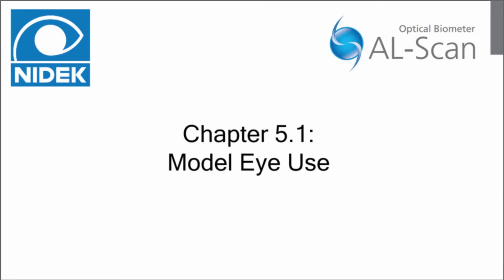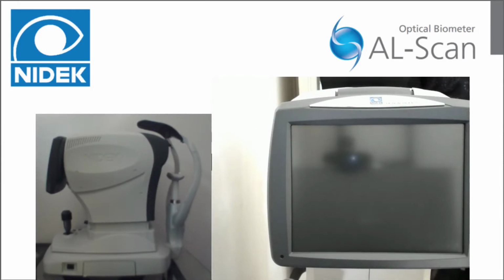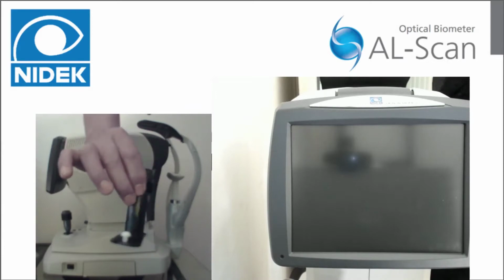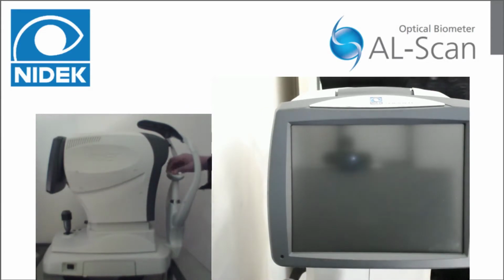Chapter 5.1, Model Eye Use. The Model Eyes are used to check the calibration of the AL scan. There are two types of Model Eyes provided with the device. Use the AL model to check the AL or KM measurement. Use the ACD model to check the ACD measurement.